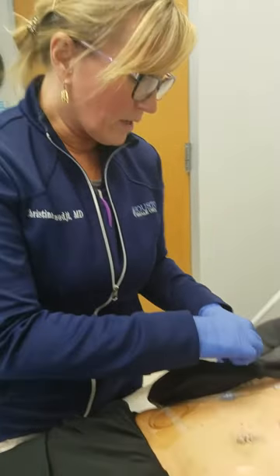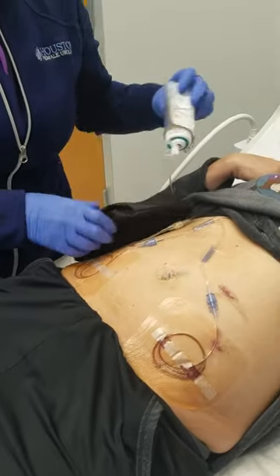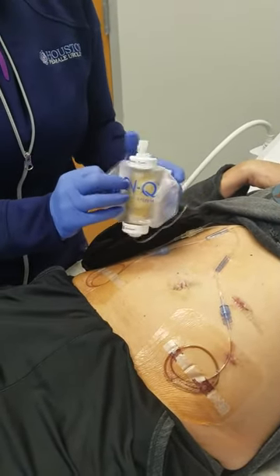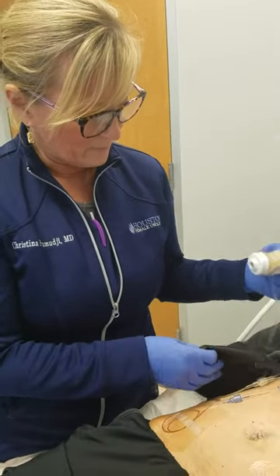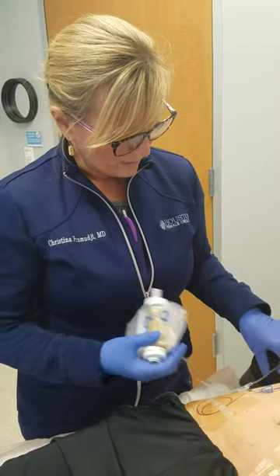I'm going to show you here the medicine ball, and it has now run out of medicine — it's totally flat. When this patient left the hospital, this was very full of medicine like a big round tennis ball, and now it's flat. The medicine's all gone. The Ocu Pain Pump really helps decrease the need for pain medication.